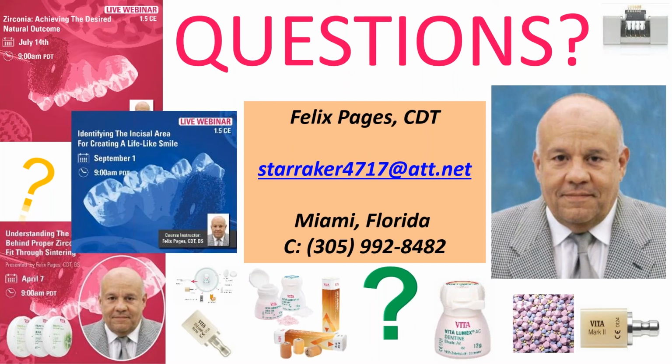So, to lower the value so you don't see it: the thinner you are, the more your framework has to look like the final shade. So I would take that zirconia coping and take it down as much as I can. I've taken them down to 3/10 in the white stage. Actually, you have to do the calculus because it shrinks. I don't like grinding on the sintered zirconia except with a rubber wheel filled with diamonds, and I take that down a little bit. I've taken them down to 3/10 in some areas.